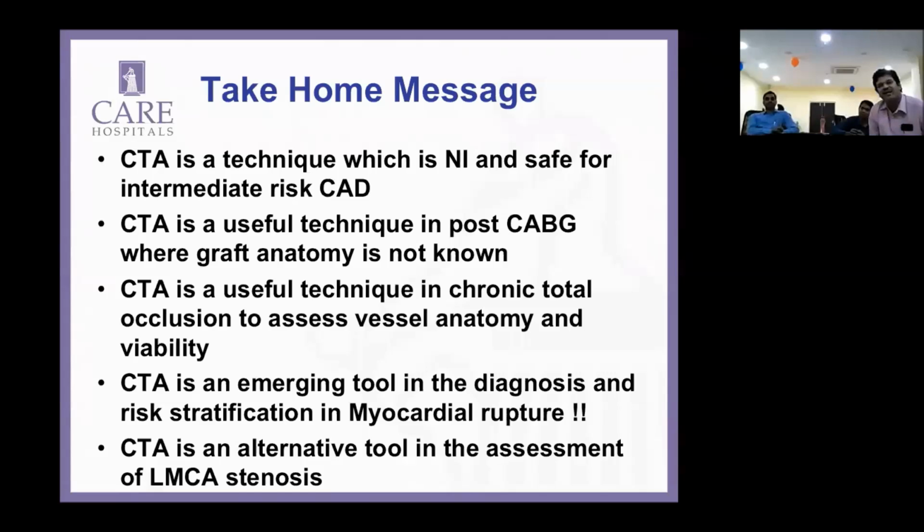One doubt I got in one of the cases: in the RCA, we had no blood flow, whether antegrade or retrograde. If the vessel is not at all visualized in the antegrade or retrograde, no visualization of the vessel at all, do we still need to look at the viability?